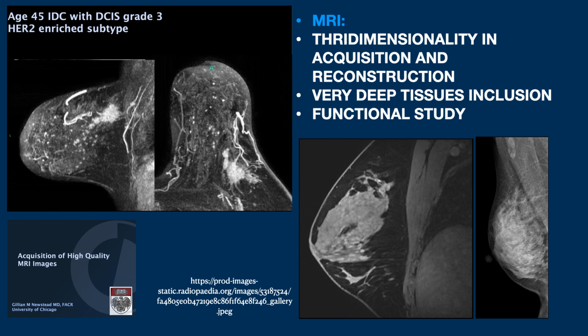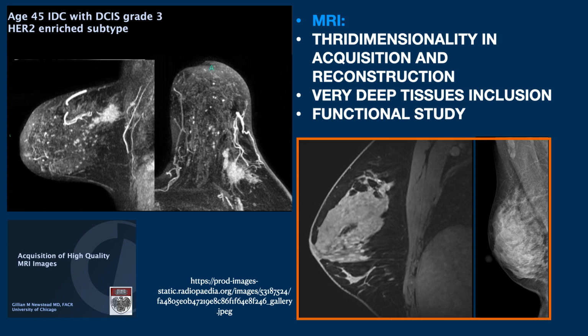The second one is being able to include very deep tissues, which is impossible to get even in a very well-performed mammogram. But what makes the real difference between the two is the possibility of getting functional data.